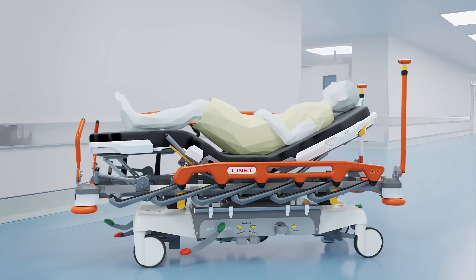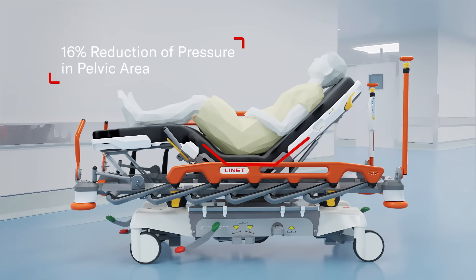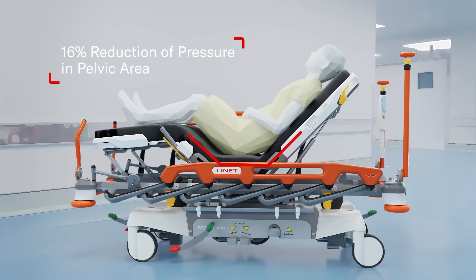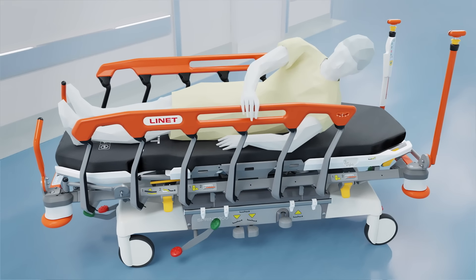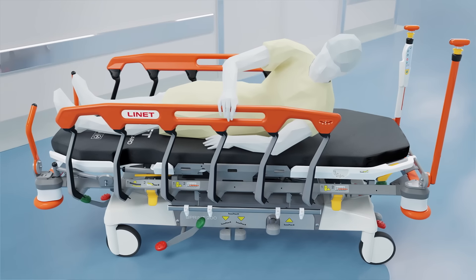To help the patient feel comfortable during positioning, ErgoFrame reduces the peak pressure in the pelvic area by 16% and reduces sliding-down forces. And if needed, the unique MobiGrip feature can help the patient with self-positioning to prevent immobilization.